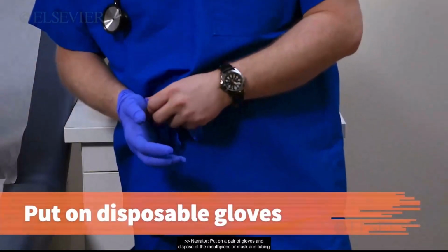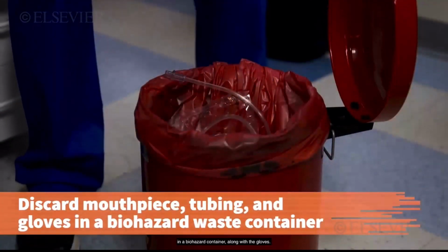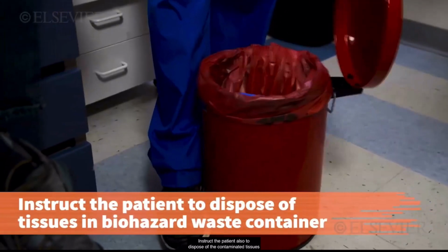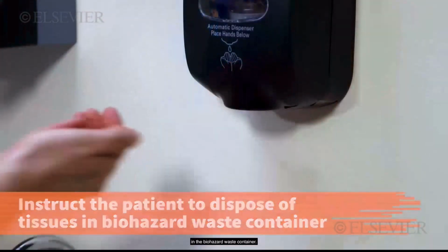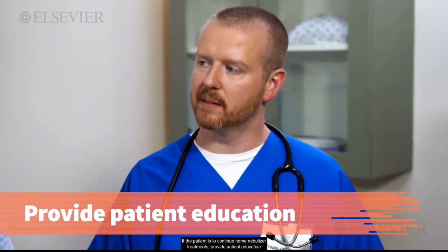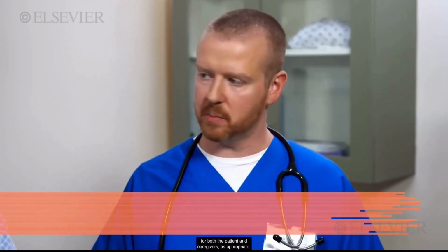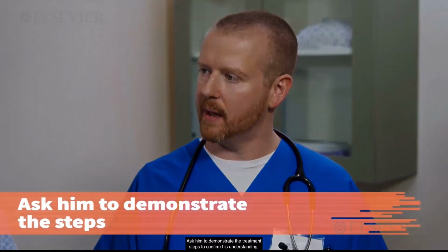Put on a pair of gloves and dispose of the mouthpiece or mask and tubing in a biohazard container along with the gloves. Instruct the patient also to dispose of the contaminated tissues in the biohazard waste container. When you're finished, sanitize your hands. If the patient is to continue home nebulizer treatments, provide patient education for both the patient and caregivers as appropriate. Ask him to demonstrate the treatment steps to confirm his understanding.